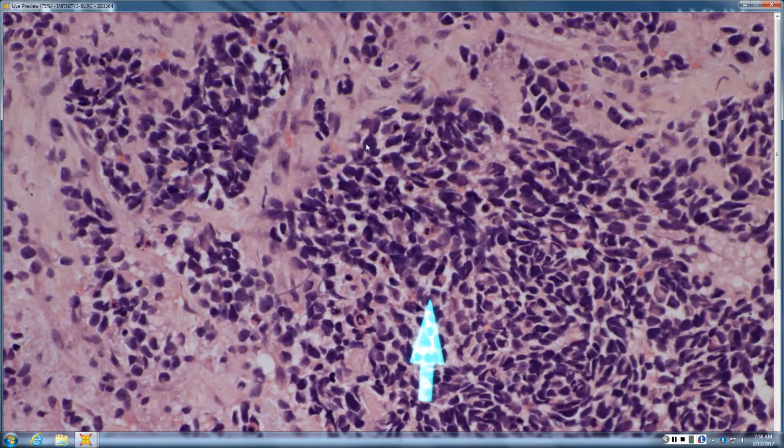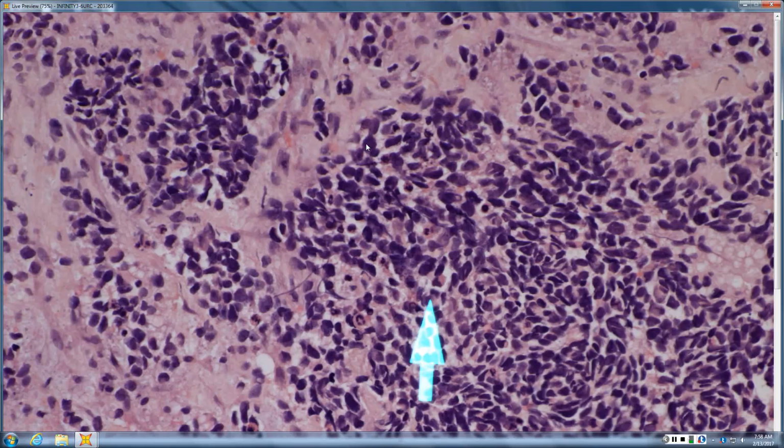Or rhabdoid because it's a rhabdo. So rhabdomyosarcoma. Melanoma is usually not in the small blue cell tumor differential, but rhabdos are. So this is where rhabdoid gets its name, because it's the morphology. You've got a small blue tumor that just here and there is tipping its hand that it is trying to form muscle by creating those rhabdoid cells.